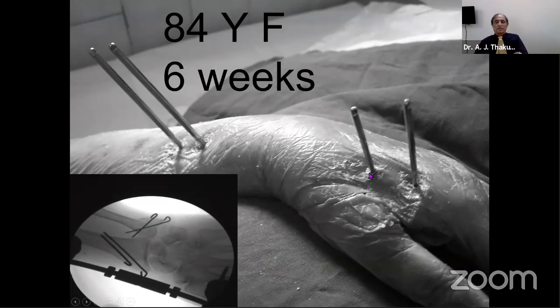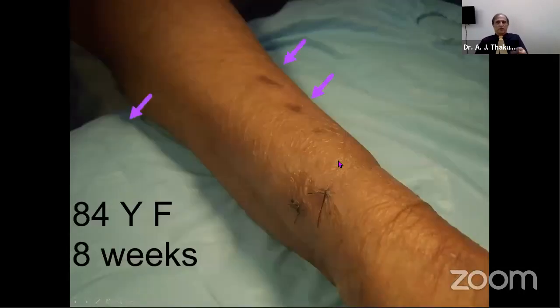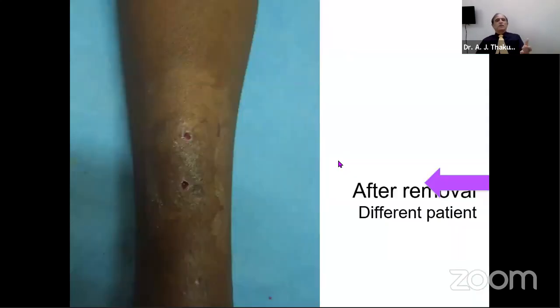In fact, you can see a scale here, which is very, very dry. And those pins, once I removed them after 2 weeks, everything healed very, very satisfactorily. Even the fresh one which comes out is no big deal, nothing. They look very good on that.